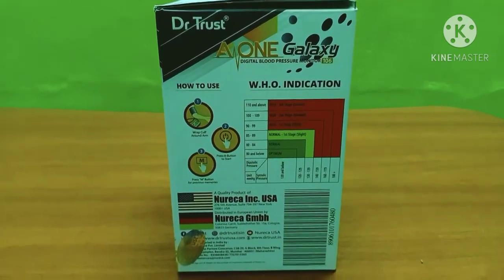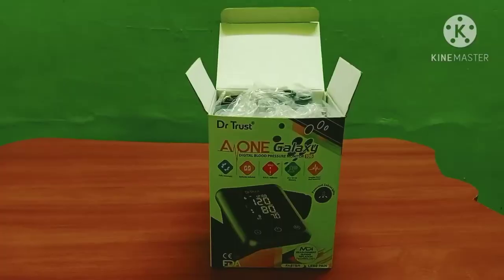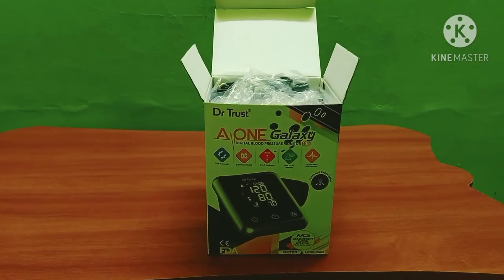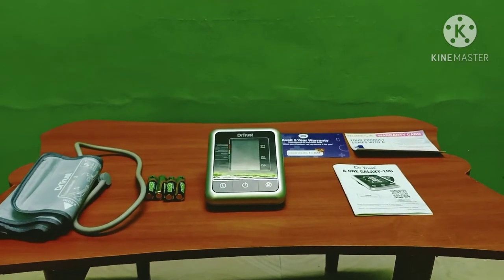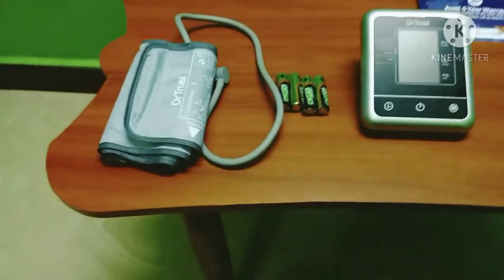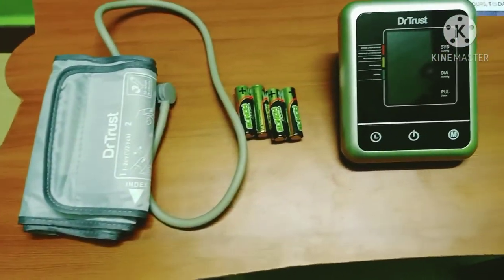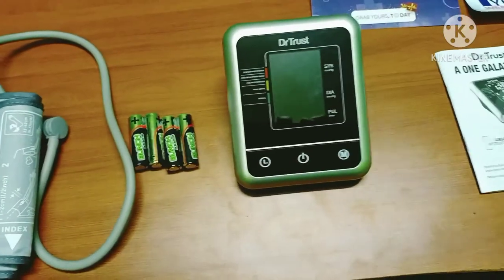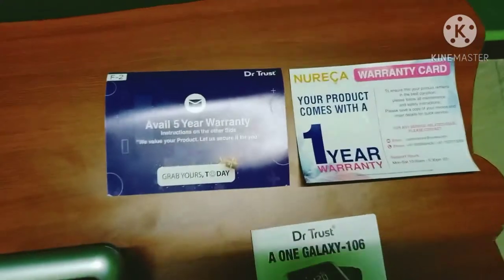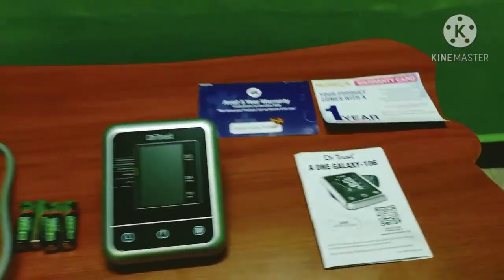Let me open the box and show the design. Inside, there is a hand cuff, 4 batteries, a BP digital monitor, a user manual, and a warranty — 5 years plus 1 additional year, giving a total of 6 years warranty.